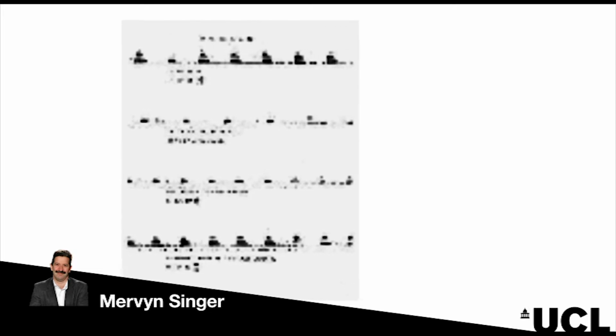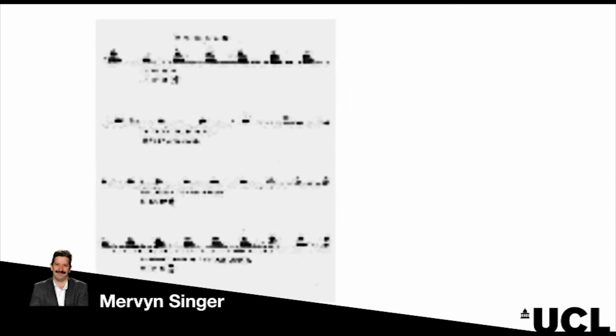And this example here shows a patient who'd had a myocardial infarction. He came in hypotensive, but was reasonably all right. 2 days later, however, he had a further myocardial infarction, and now his blood pressure was unrecordable. He was in cardiogenic shock. And the Doppler waveforms showed a much, much smaller stroke volume. So the area under the waveform represents stroke volume.